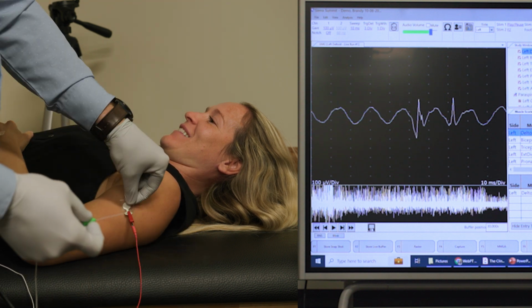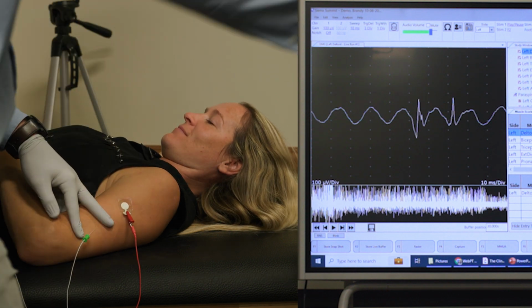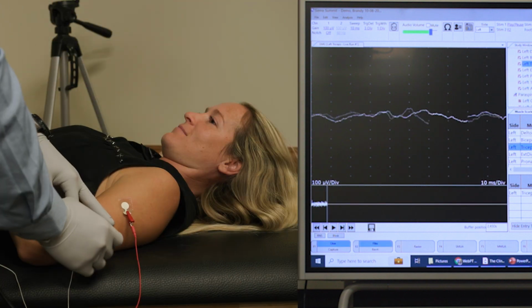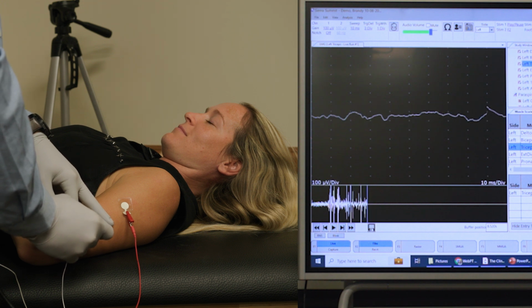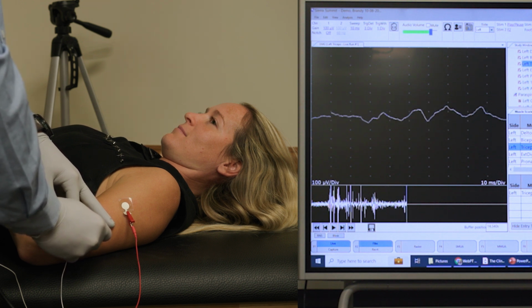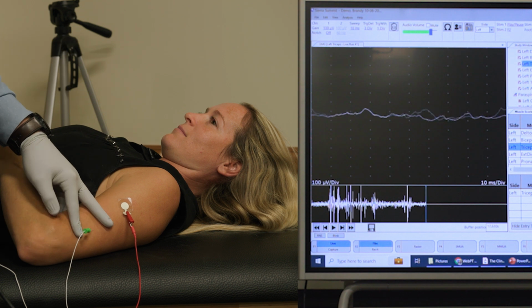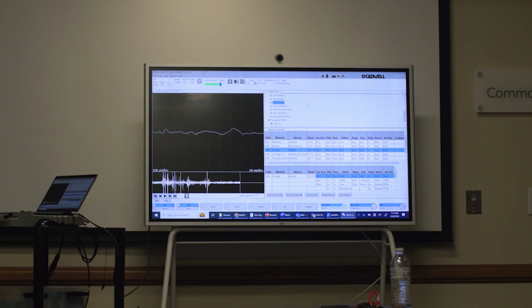So there's the deltoid. We'll just do a couple more. We'll do triceps here. Another poke. So we're in muscle tissue here, electrically silent when the muscle's at rest. If we did see spontaneous, rhythmic, there's a couple characteristic electrical potentials that we're looking for here, and those tell us if the muscle is not under active neurologic control and is deinnervated or the muscle membrane is unstable, and that would clue us in that there is a problem somewhere along this nerve track going up.